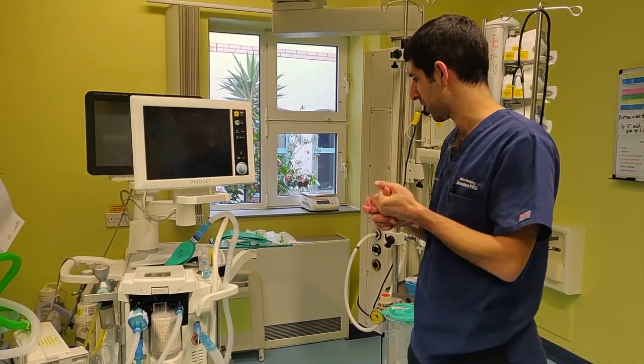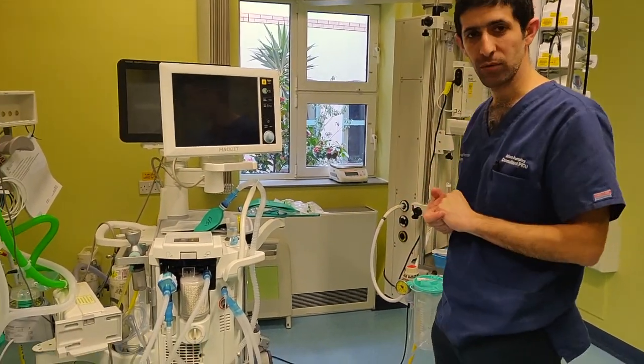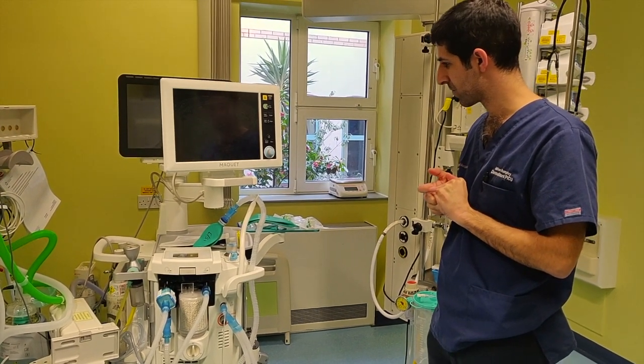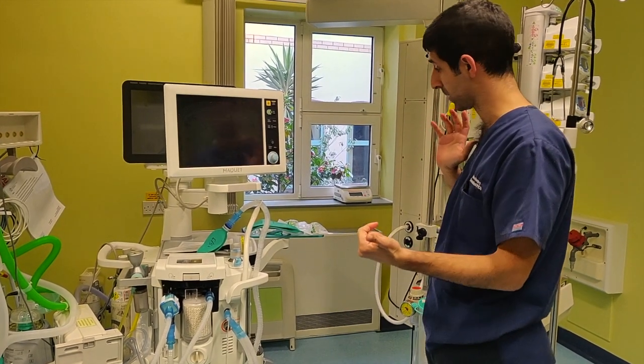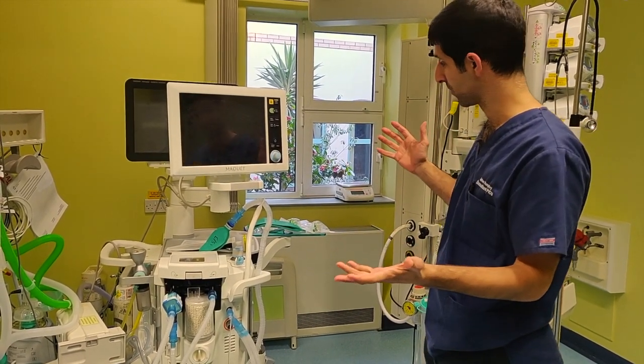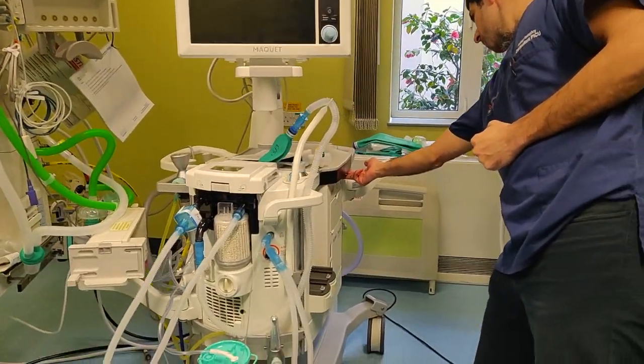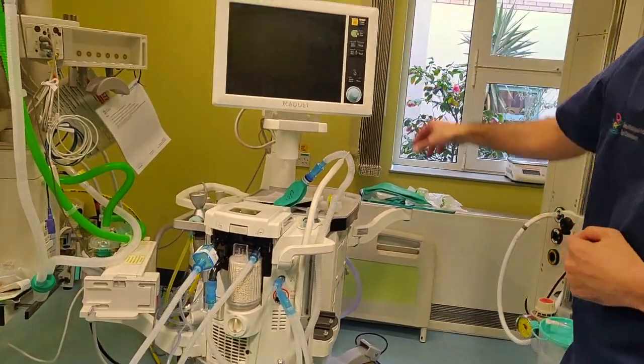So, a quick video about the Flare ventilator, which you won't have used before if you're an ICU doctor. It's quite straightforward — it tells you what to do most of the time. First thing to know is where's the off button. It's down the side here, under the flap. Just push — it takes a bit of time to set up.